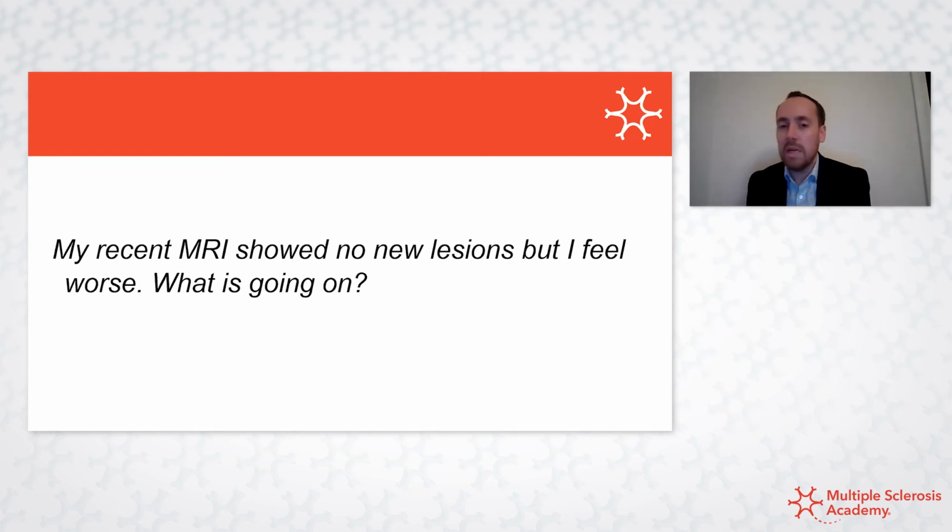So with the updated NHS England blue tick for siponimod, if someone's had disability progression on a treatment and their MRI is stable, we don't need to wait for new lesions or a relapse to escalate those patients who are slowly progressing. And that feeds into those new ideas we've got about progression independent of relapse activity that we've discussed in these webinars earlier in the year.